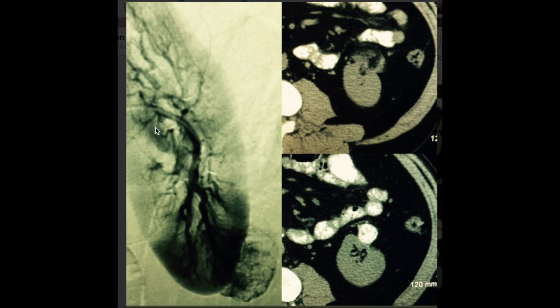And here's the image from the arteriogram where I have a catheter in the renal artery. We obviously went out a little further, but the tumor is this thing here sitting on the outside of the kidney, and we worried that it'll bleed. You can see there's some really abnormal looking blood vessels here. And then finally, this is a follow-up image after the embolization, showing the material that is staining the tumor, and the tumor has clearly dropped in size, and this is basically a dead hardened tumor. This was all done through a small pinhole in the groin in this case, but the same procedure can now be done from a pinhole in the wrist.